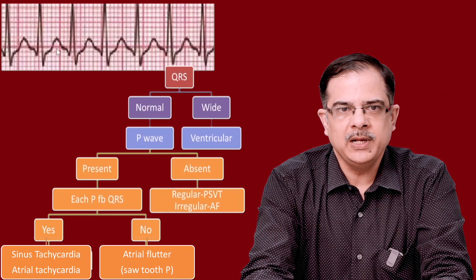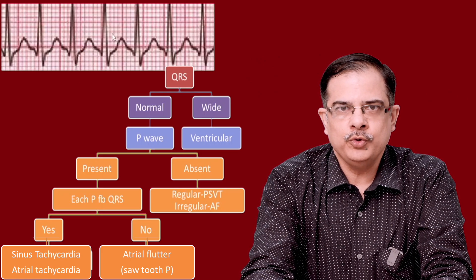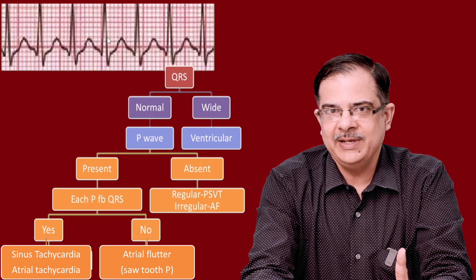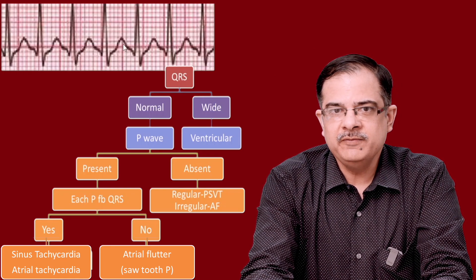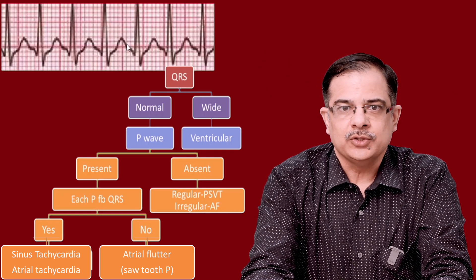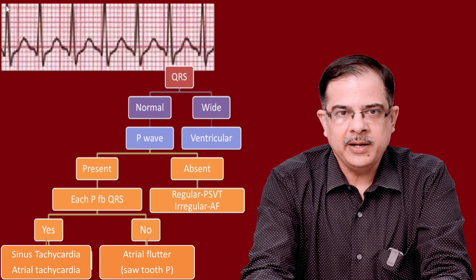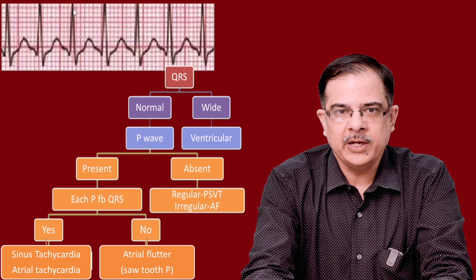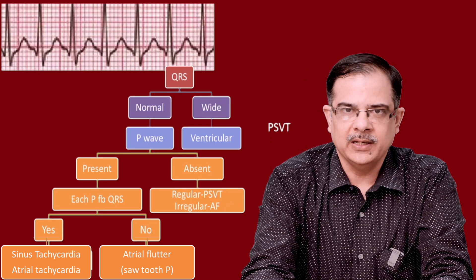Next ECG: QRS complex is normal in width. Looking at P waves between two QRS complexes: usually there should be two waves — one T and one P — but only one wave of the same morphology is present throughout. Considering this as a T wave, P wave is absent. It could be PSVT or atrial fibrillation. The RR interval is fairly regular, indicating a regular rhythm. Therefore the diagnosis is PSVT.